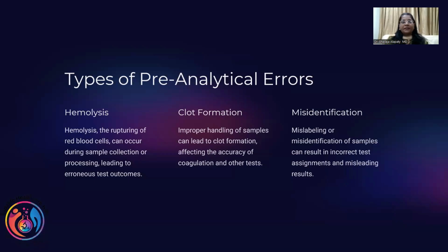Now, types of errors. As I told you, what we don't see and what we see. Red blood cells, hemolysis, clot, microclots. The WBC is gone inside, the RBC is gone inside, the platelets are inside the microclot. Then what values will you get? 100% it will be wrong. And that is when you have to look into the histogram in the system.